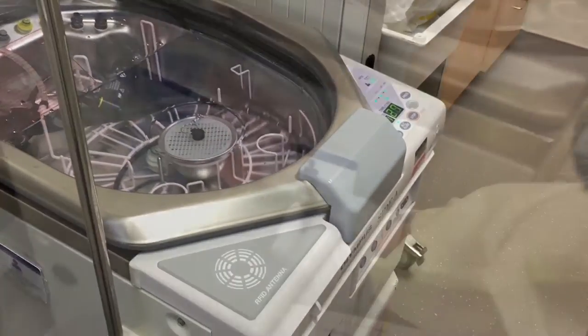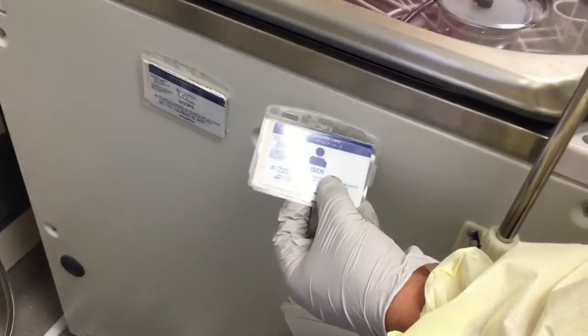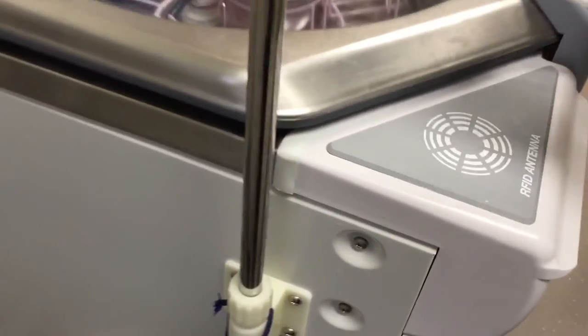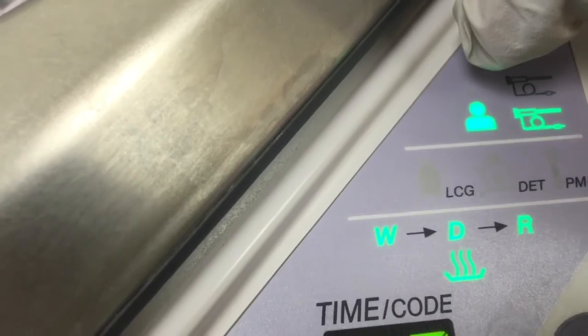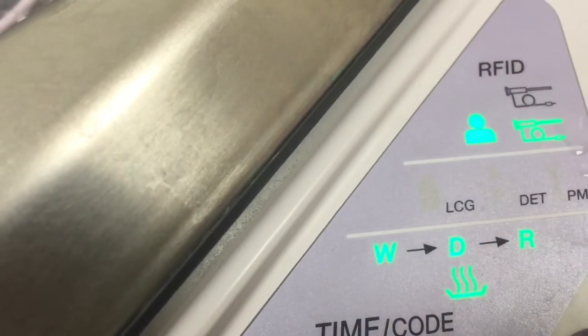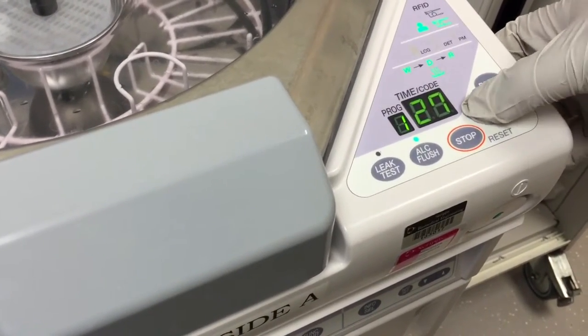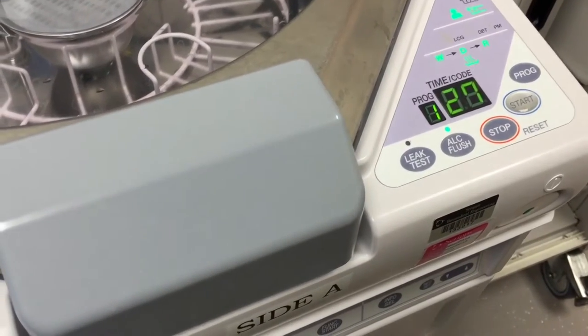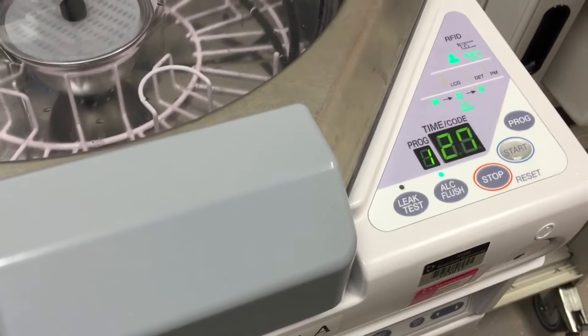and firm. Next thing, we'll use the Master Card or Master User and pass it in front of the sensor, and you'll see that the face of the person will be illuminated, approving the card. Next thing, he'll be pressing the start button. Press the start button. It'll take about 28 minutes for the process to complete.